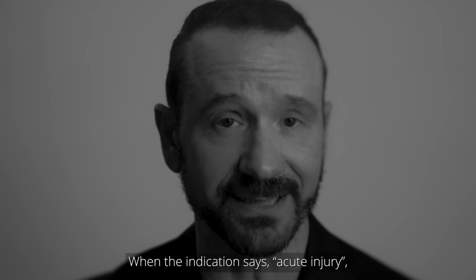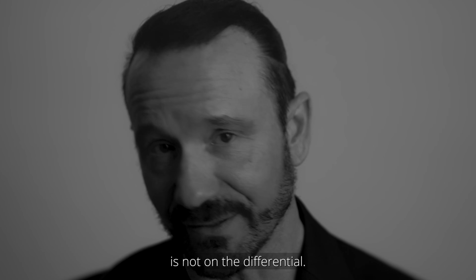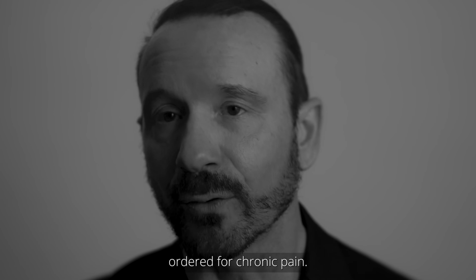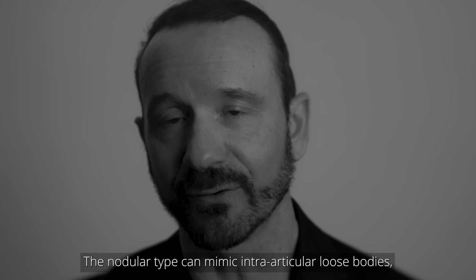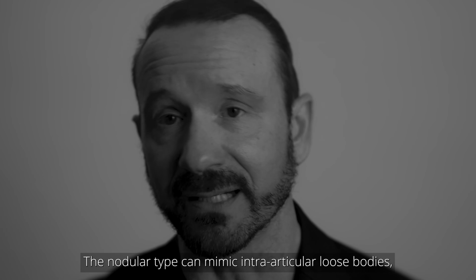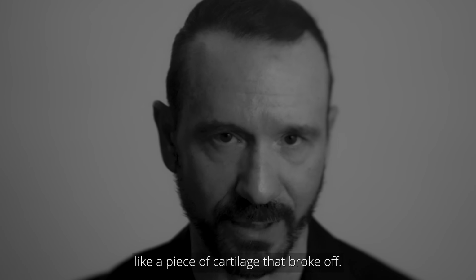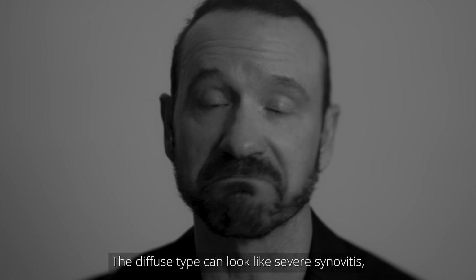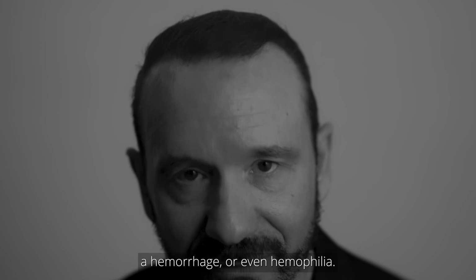When the indication says acute injury, TGCT is not on the differential. More commonly, TGCT presents as an incidental finding on MRI ordered for chronic pain. The nodular type can mimic intra-articular loose bodies, like a piece of cartilage that broke off. The diffuse type can look like severe synovitis, a hemorrhage, or even hemophilia.